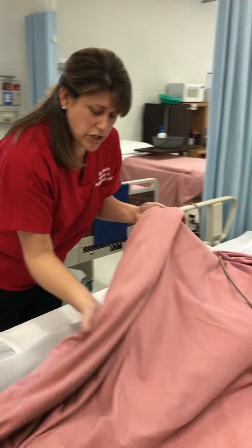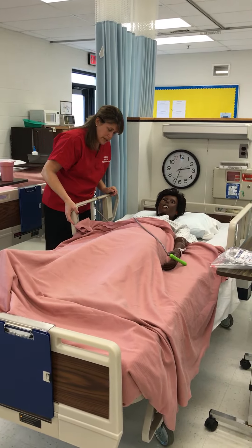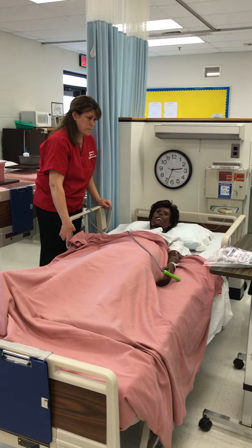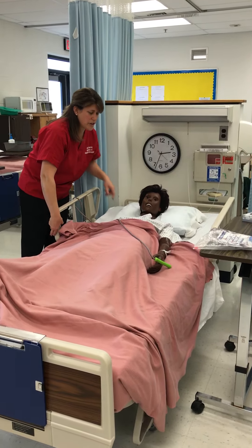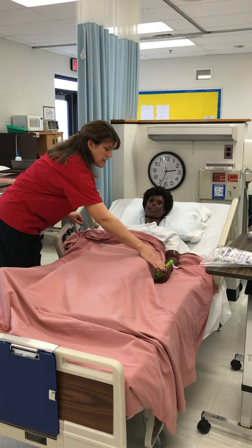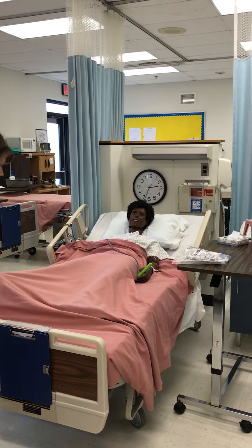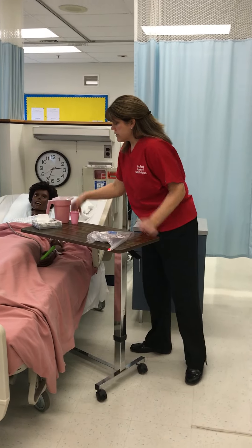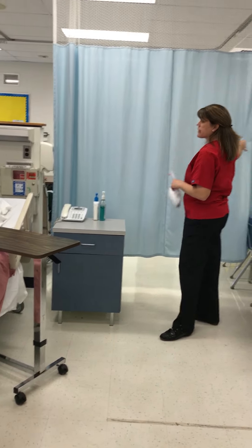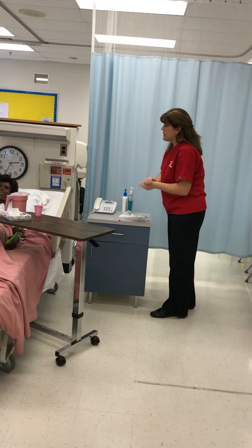Back to our patient. Ms. Hudson, great job. We're going to go ahead and get you tucked back in. Lower your bed so you're nice and safe, and raise you so you're comfortable. I see that you have your call light. Your bed is low and locked. Both of your side rails are up. Here's your water and your tissues — make sure you can reach that okay. Let me go ahead and address your privacy — would you like your curtains open or closed? I'll leave them the way they are. I'm going to go ahead and wash my hands as I walk out of the room. Please call me if you need me at all. Thank you.